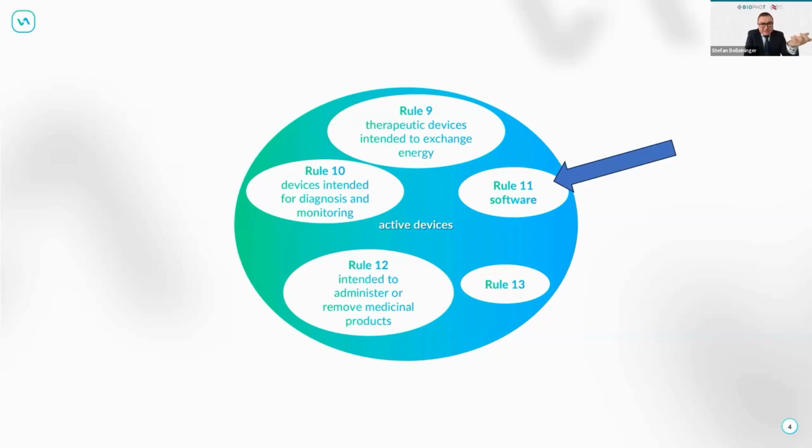Now, 2014 to 2017, when MDR and IVDR were created and rewritten, they introduced Rule 11 for software. That is a rule written only for medical device software, either in a device or as a device. And that rule deals with the following things.